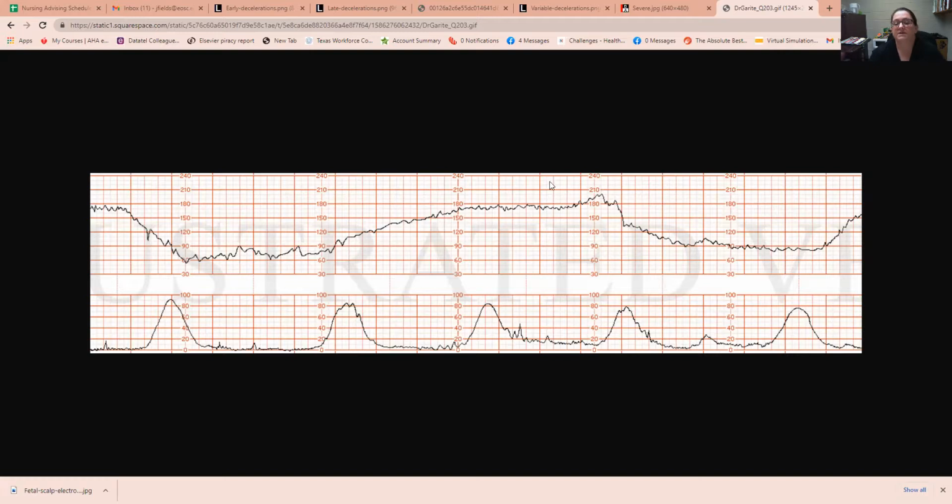It is better. This fetus is going to be acidotic after an 8-minute decel. The fetus tends to recover better from that acidosis if they can safely stay inside and let the mother deal with the byproducts of that recovery. But if they continue to have long 8-minute decels, they're not going to recover from the acidosis. They're just going to get worse and worse. So one of the reasons to let them stay inside for a bit is to give them a chance to recover if the fetal heart rate is reassuring.